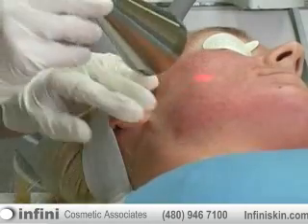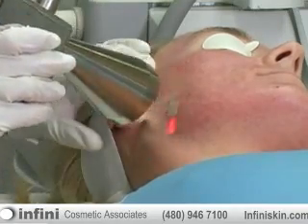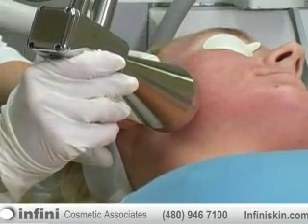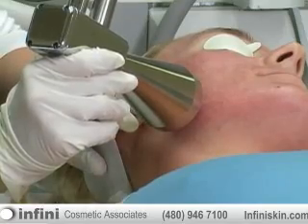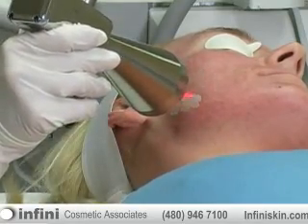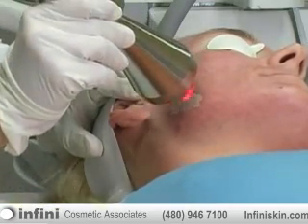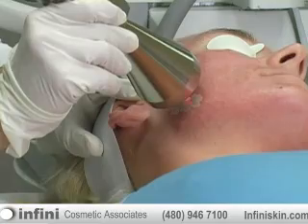Today we're here demonstrating a really unique procedure that we love here at Infini Cosmetic Associates. It's what we call a micro laser peel. It's a very powerful tool where we use an actual erbium laser to do a very light laser resurfacing, hence the term micro laser peel.